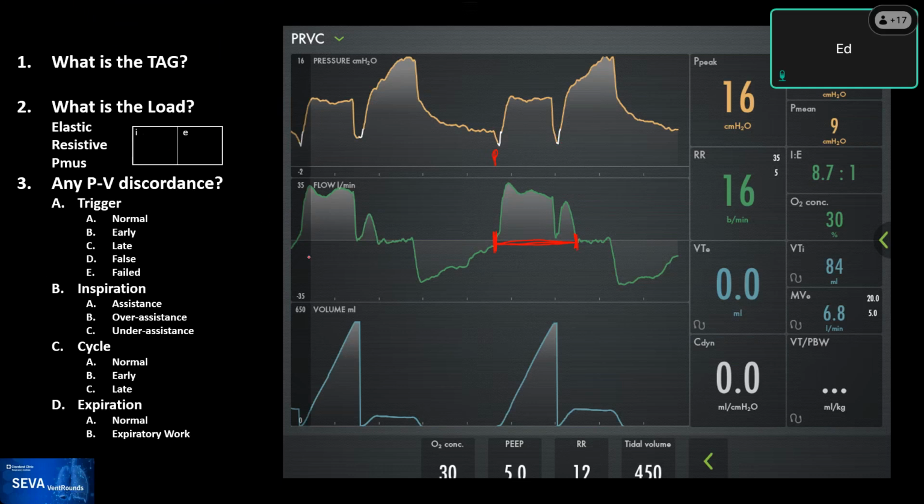You can see the same on this one now. You have two, it goes all the way from here to here. And actually this makes the point. You can see that there's no flow, so the patient is relaxed. There's no flow because this ventilator doesn't let you exhale unless you pass a certain threshold. And you can see that the pressure now is demonstrating what would be the pressure of the relaxed system, so the plateau pressure in the respiratory system.